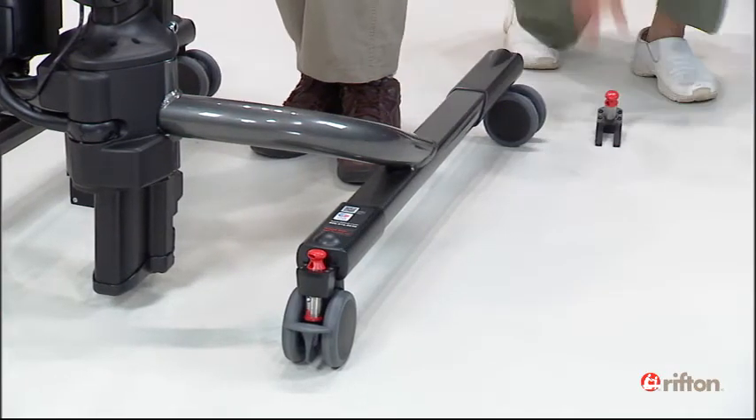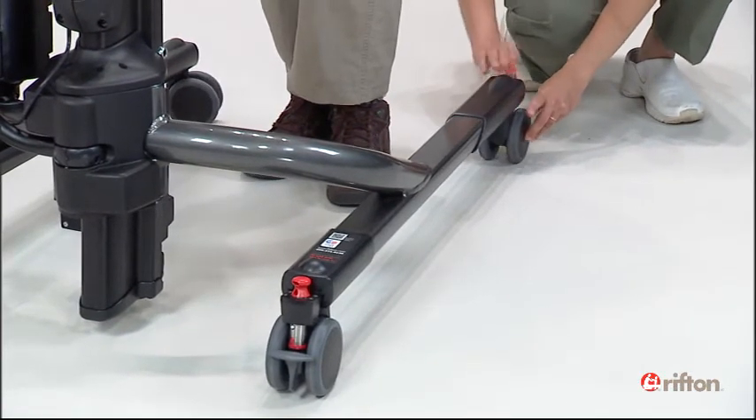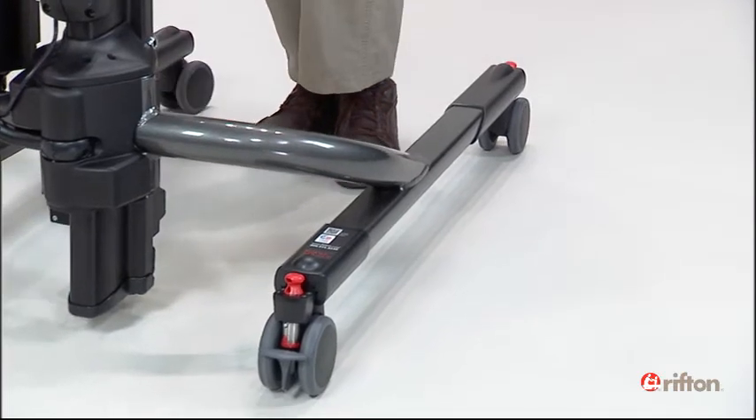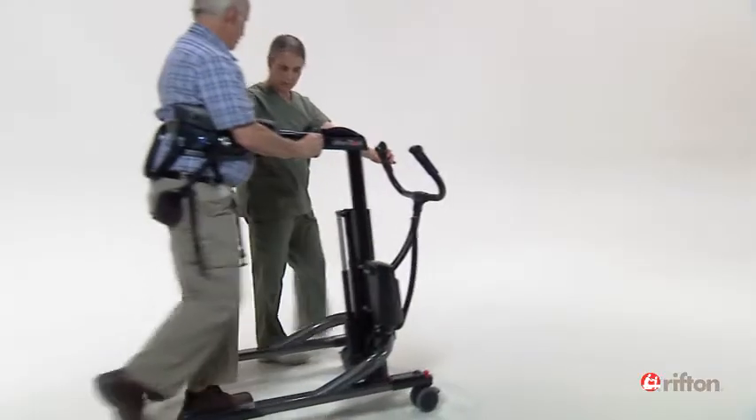Locking one front and one rear caster will direct the tram in a straight line. This is particularly helpful if your client has trouble controlling lateral movements and needs practice on forward movement without steering.